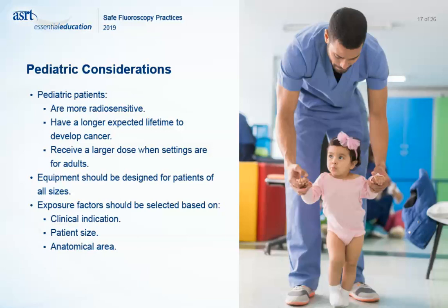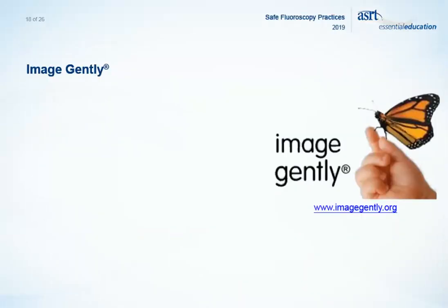Operators should identify practices that reduce radiation dose to the child, apply equipment modifications that reduce the child's dose, and adopt appropriate pediatric practice guidelines. Following ALARA means using pediatric protocols when appropriate and modifying exposure factors if necessary.